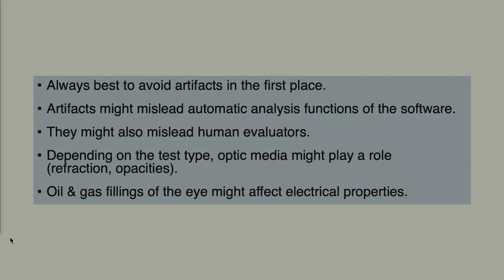And to say a bit more, and also to be a bit redundant partly, it's always best to avoid artifacts in the first place. It's not always possible, especially if you're not doing the measurements yourself, but just get the report.